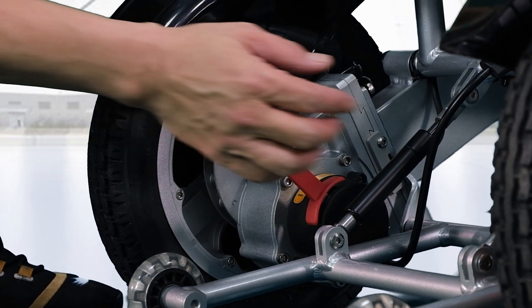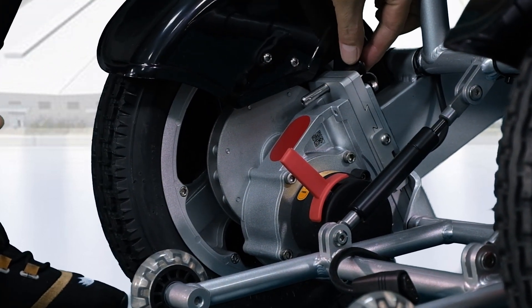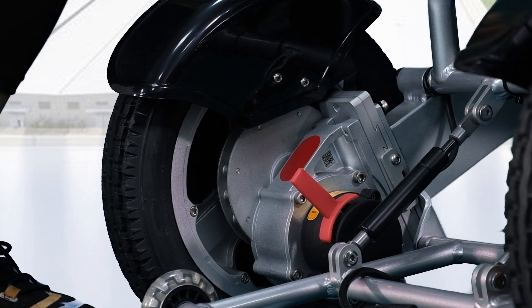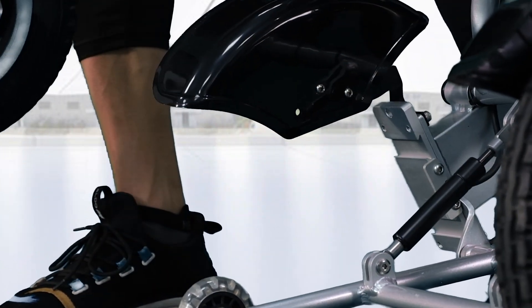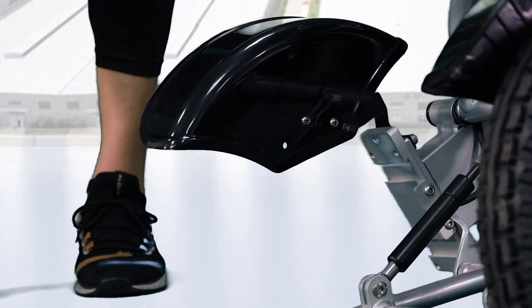The detachable motor and wheel is simple and easy. Just unplug here, touch the pin on the top, and then take out the insert. This way, we can slide out the wheel along with the motor to reduce the weight of the wheelchair if you want to load it somewhere.